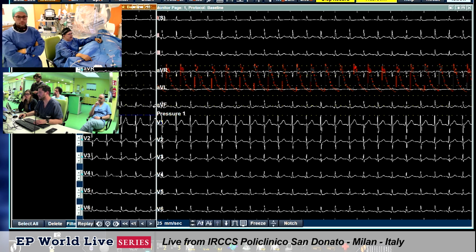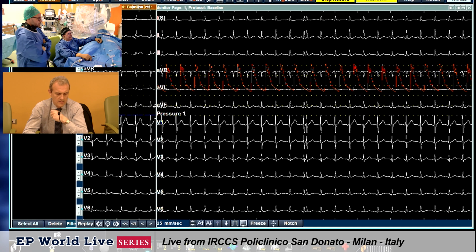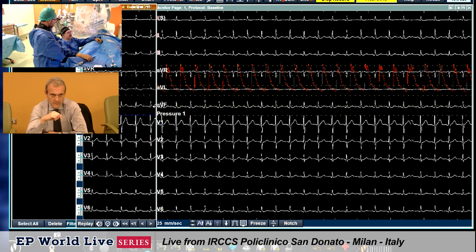Do you see, Giovanni? Yes, I see well. Okay. I think we can be satisfied. We do the Ajmaline test.